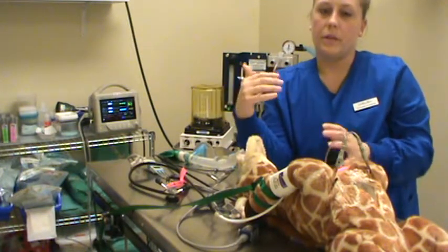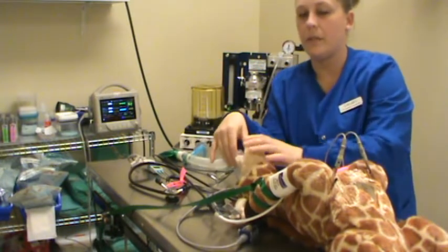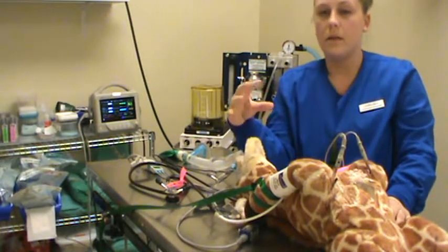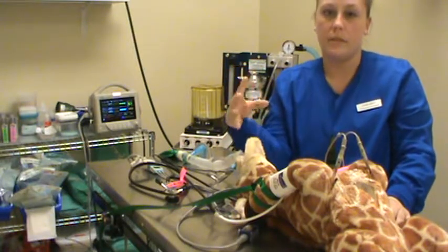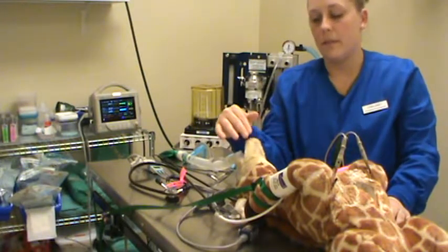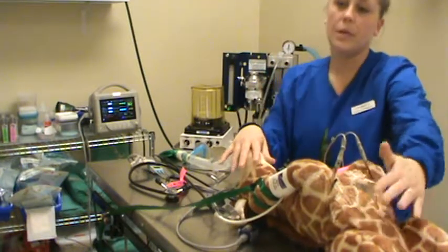Last one here, we're going to look at the patient and assess the respiratory pattern. If their breathing has gotten really rapid and the pattern is just fast, fast, fast, fast, they're panting, that is a sign that they're too light. So that patient needs to be turned up a little bit. So that was stage 3, plane 2.